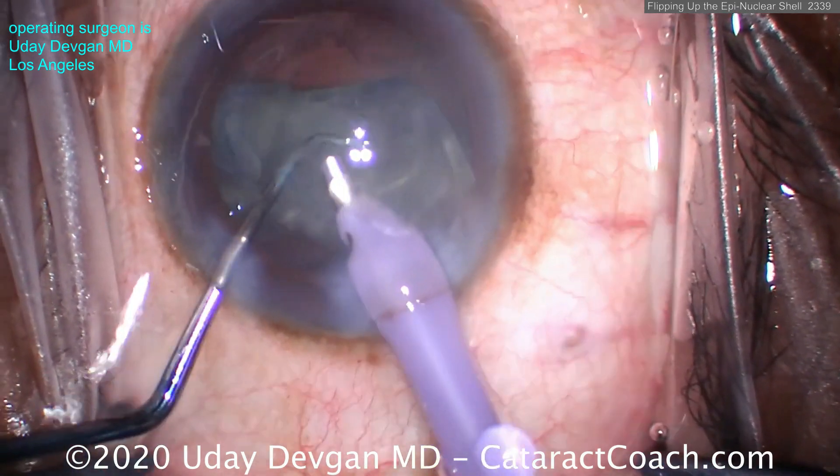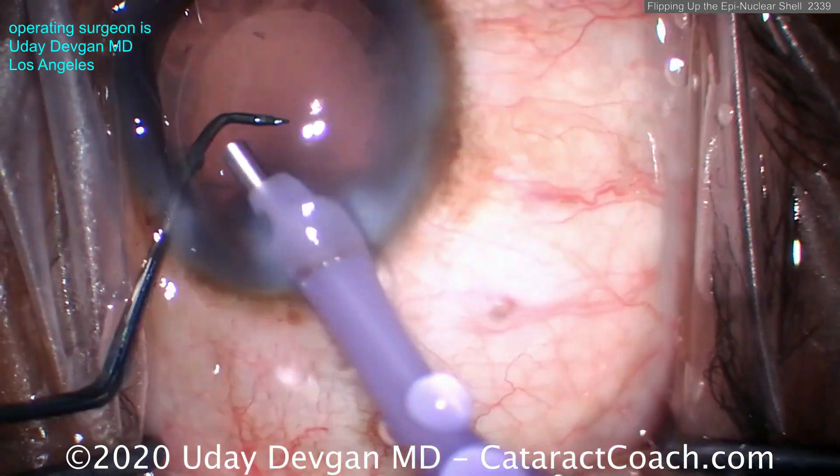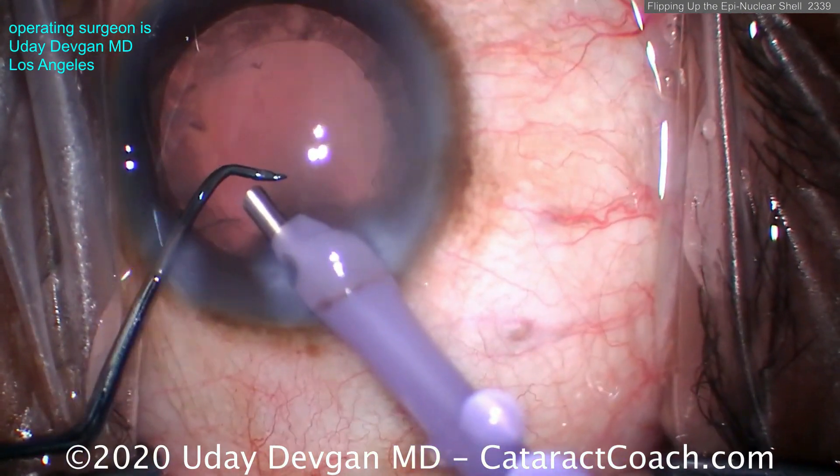Here's another one — a big, dense, thick epinuclear shell. If I can grab it and get it out of the bag, see how the chopper pushes and flips it? You want to flip that shell, and then it comes out pretty easily.